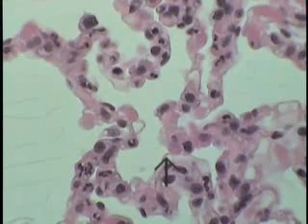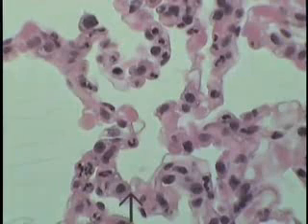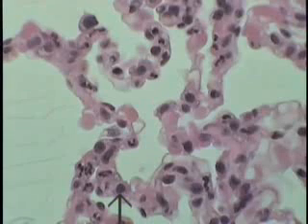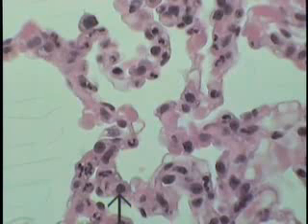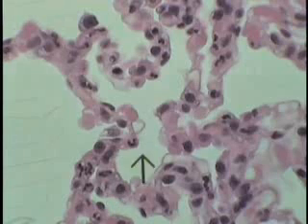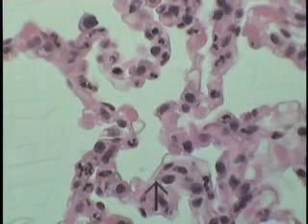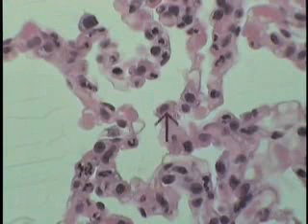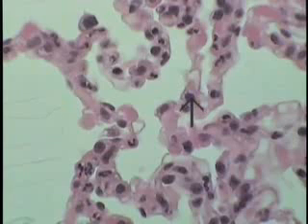It's almost like an interface. These cells, as shown here, and countersunk in, that have a vacuolated appearance, they're more round or cube-like in nature, are type 2 pneumocytes, and these are the cells that are producing alveolar surfactant and trying to reduce the surface tension within the little fluid lining the interior of the lung. So this is an example of a type 2 pneumocyte here. Another is shown here. Another is shown here.